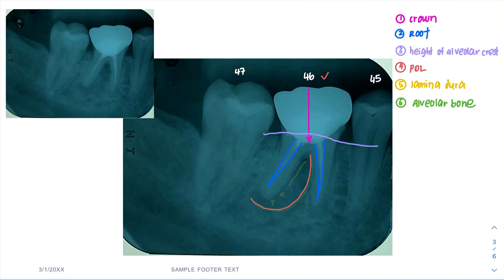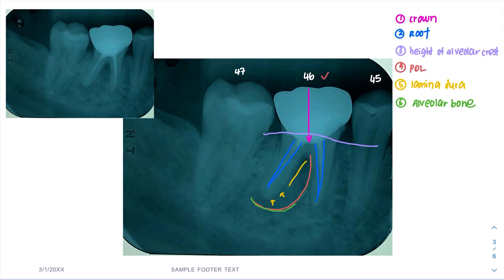Next is the lamina dura. The lamina dura also has loss of continuity here — loss of continuity at the distal apex of the root, and it also extends until the furcation area. The last one is the alveolar bone proper, which shows ill-defined radiolucency at the apex extending up to the furcation area.